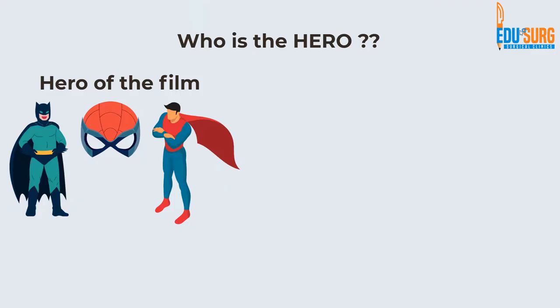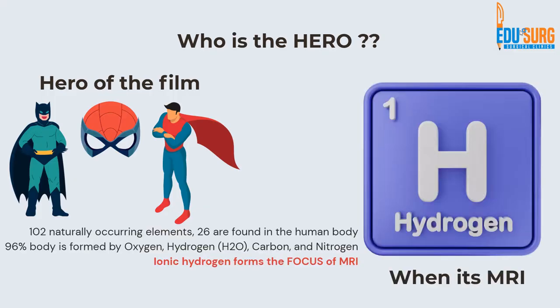Whenever we see a film, it is a common question that we think about who is the hero of the film. It can be Spider-Man, Superman, Batman. It can be Amitabh. It can be Shah Rukh. It can be a heroine-led movie, right? Similarly, when we are discussing MRI, the one key hero that you need to remember, and the entire discussion on MRI is based on this hero, that is hydrogen.